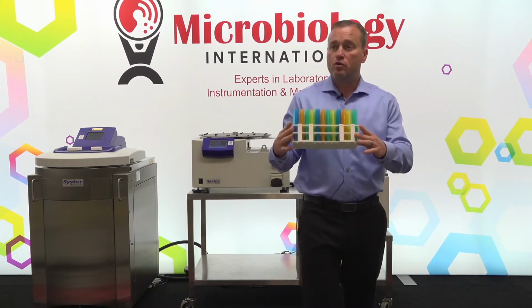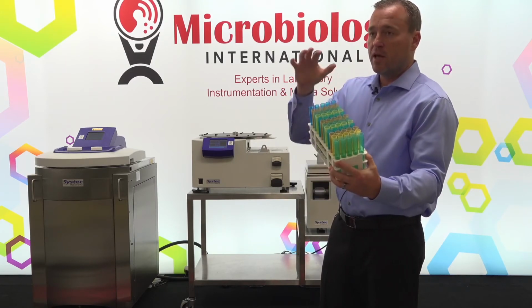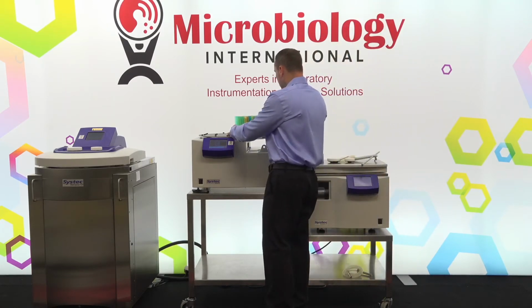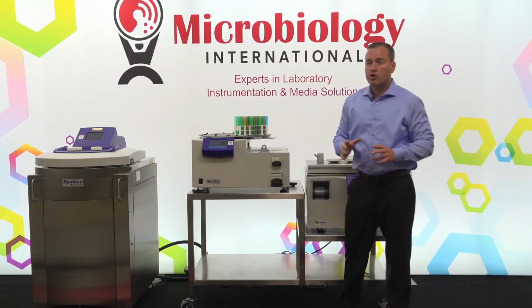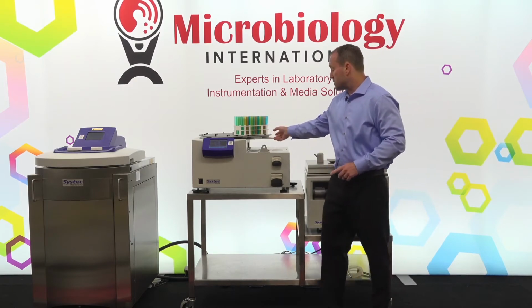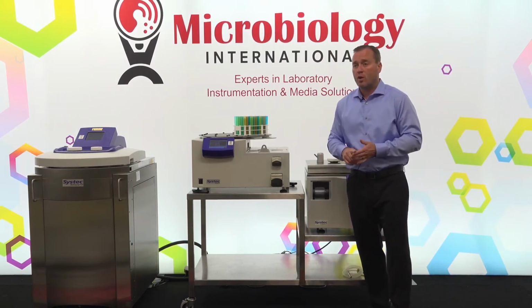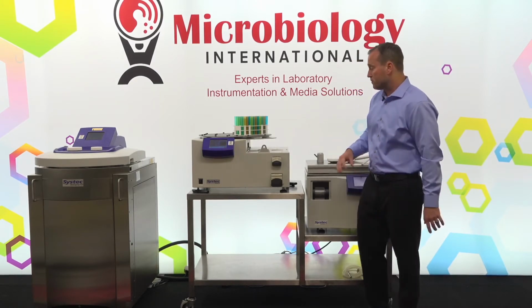Now, you do have to use these racks because they hold the tubes in a very tight position in order for us to hit the exact tube and fill it correctly. So you have the ability to put 4 racks on the base of the unit. Depending upon the size of tubes is how many tubes you can fit per rack, because all the racks are the same size. So these are for all the commonly purchased tubes. They're 13, 16, 20, 25, and 30 millimeter tubes the system is designed for with the configuration.